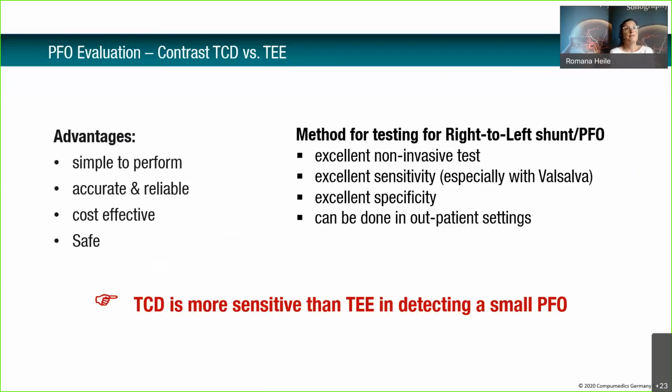TCD versus TEE, transesophageal examination. So what is the benefit?